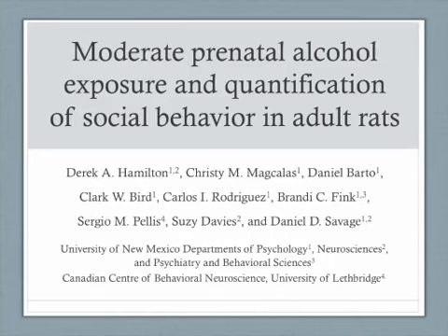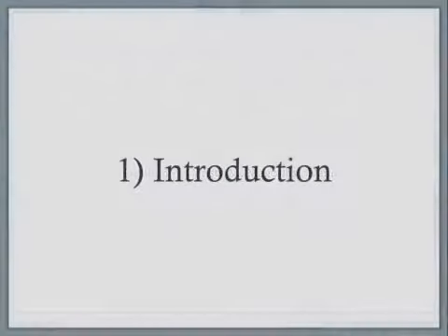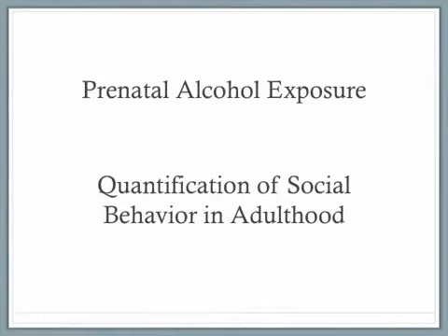Moderate prenatal alcohol exposure and quantification of social behavior in adult rats. This video describes a prenatal alcohol exposure paradigm followed by quantification of social behavior in adulthood.